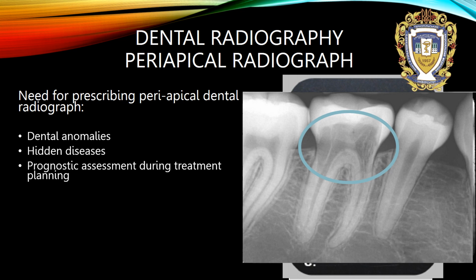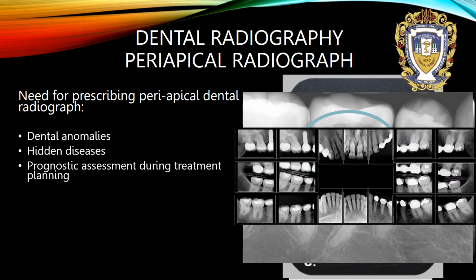Prognostic assessment during treatment planning. For this purpose, we need to have many periapical dental radiographs and complete them with a special chart to observe every tooth.